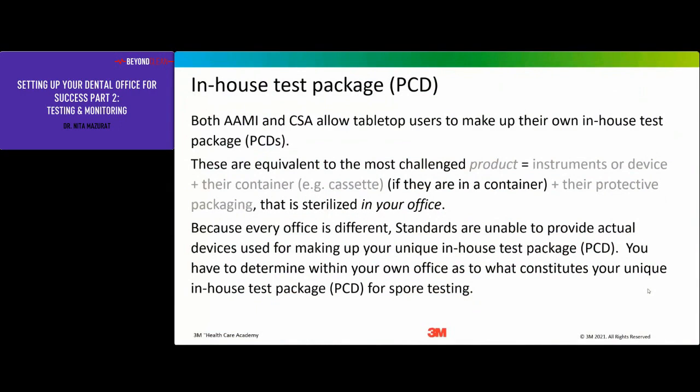So these are equivalent to the most challenged product, which means the instruments or devices. You'll notice that I'm using the term devices; it really covers, it's an umbrella. It covers the word instruments. I would love to use the word devices all the time, but as a dentist, I have a tendency to use instruments, so forgive me for that constant chameleon effect with instruments and devices.